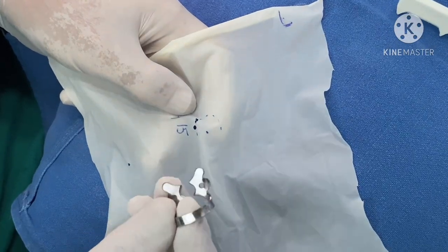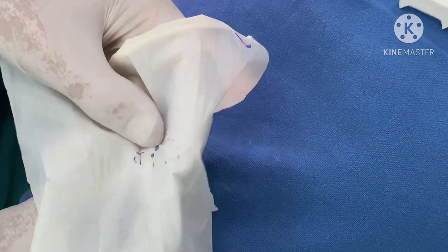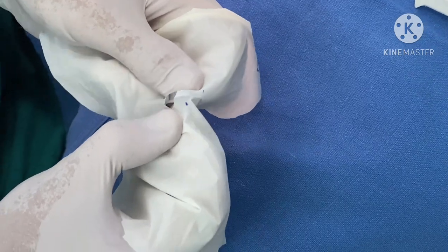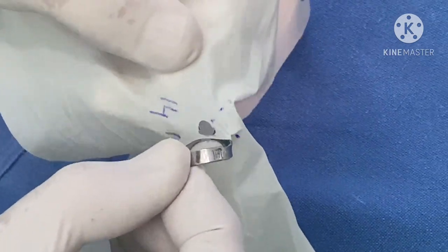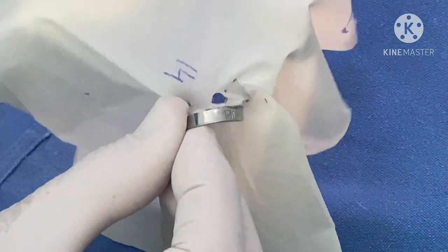Now we take the rubber dam clamp and place it on the 5. And hold tight from the left hand and then press it like this. And see that the other hole is right in the center of the horizontal bar. Then we turn it like this.